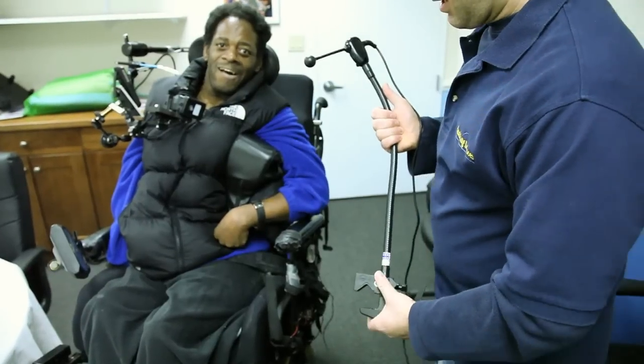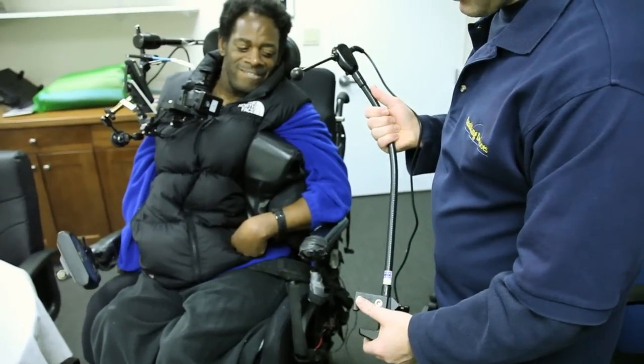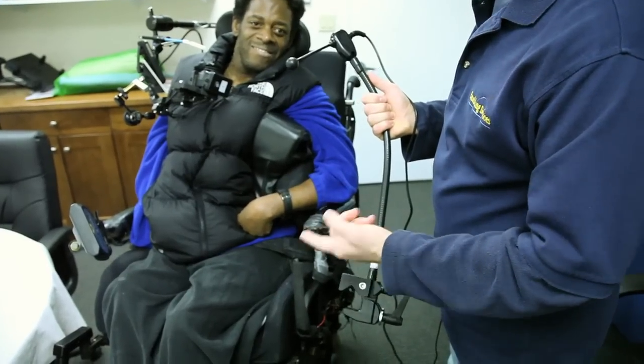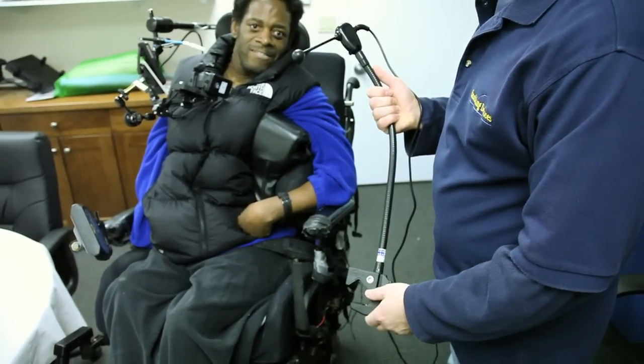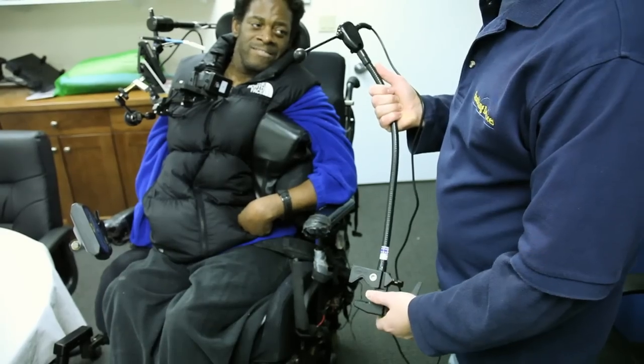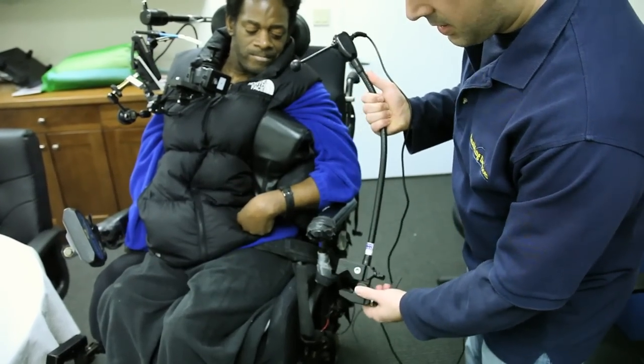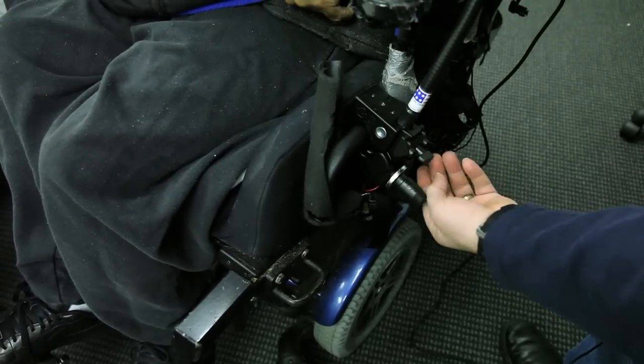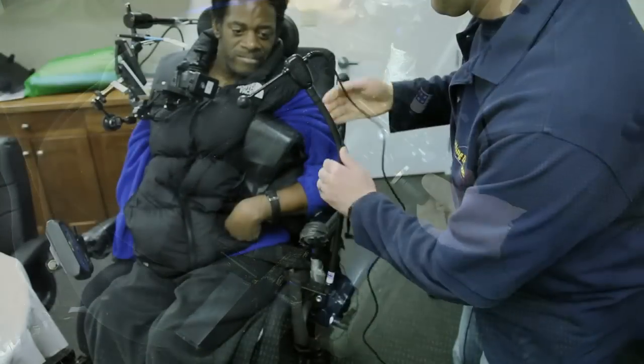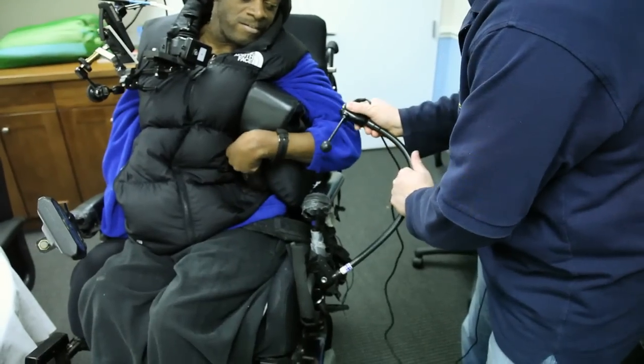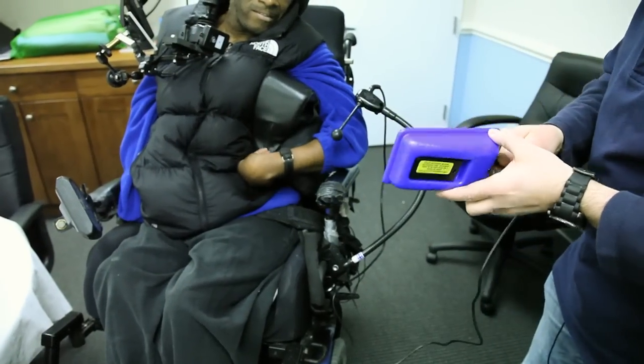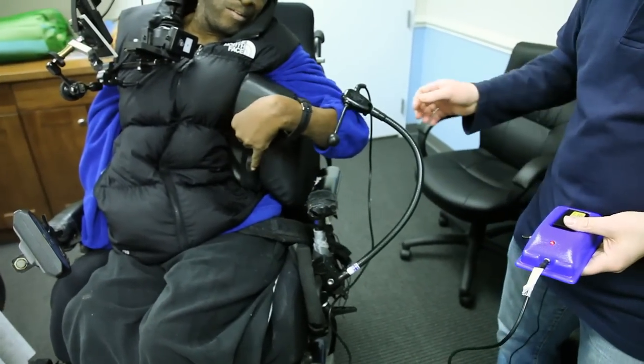Hi, today we're here with Ben, and we're going to demonstrate two of our products together. It's our item number 1671, the ultimate switch on a 19-inch gooseneck, and we're going to demonstrate that with our single appliance module, number 1490. I want to show how easy this is to use and set up. We're going to clamp this onto Ben's wheelchair. I'm going to adjust this out for Ben, so he can activate this. Let me just plug it in. Yep, that's it.